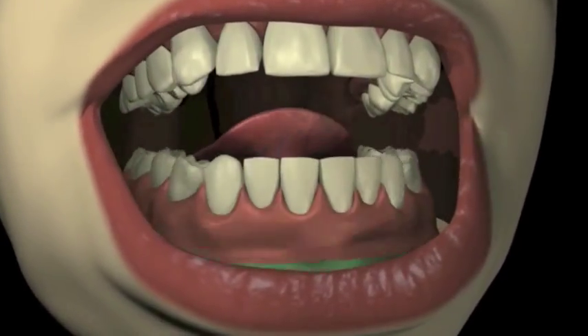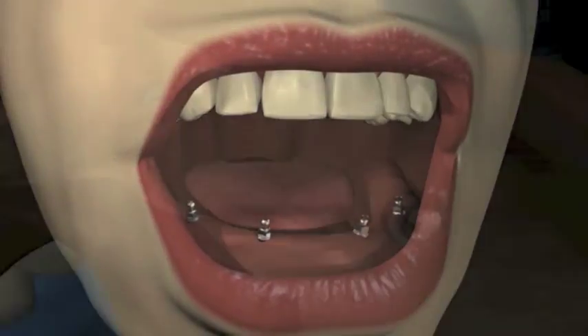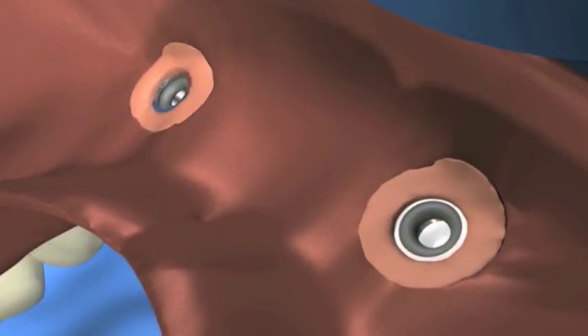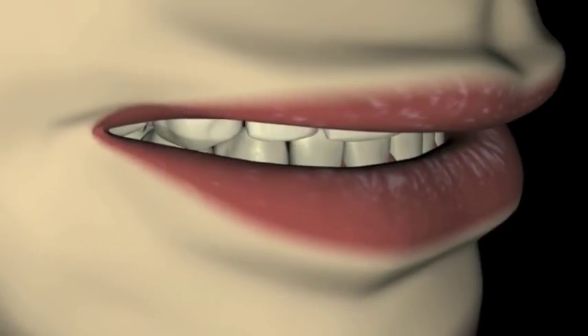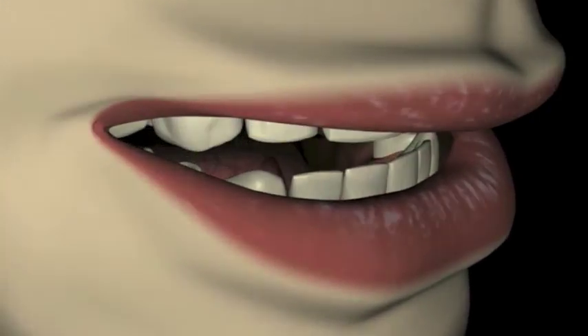Allow the acrylic to fully polymerize. After the acrylic has set, remove the denture and rubber dam. Trim flash and fill any minor voids or discrepancies. Ensure that there are no sharp edges on the tissue-bearing surface of the denture, and recheck the occlusion to confirm proper occlusal contacts.